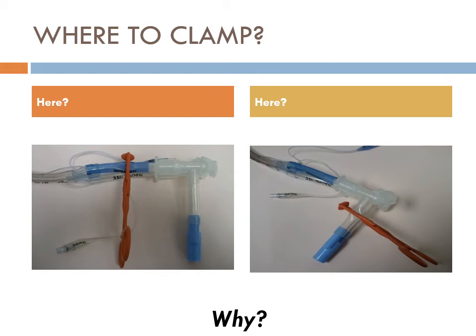This is the left side of a double lumen tube. Assuming it's in the left side, and if you had one of these pictures, which side are you ventilating, right? And you'll also notice something's wrong with that left picture too. So it's putting in play all these four pieces. Left-sided double lumen tube.